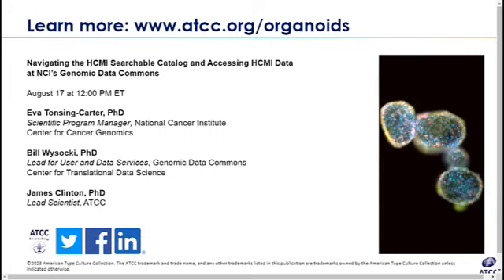Gotcha. And is each kit specific to a tissue type? I can open that up to either Steve or James to answer. I can answer that, and I'll say the answer is no. There is some overlap. Some kits are actually used with multiple tissues. It's not tissue-specific media formulations. It's slightly more complicated than that, unfortunately. So I would encourage you to look at the model-specific information that we provide for any specific organoid model, specific part number, and see what media formulation and what kit it recommends.